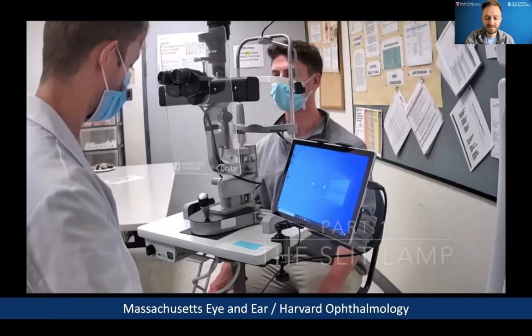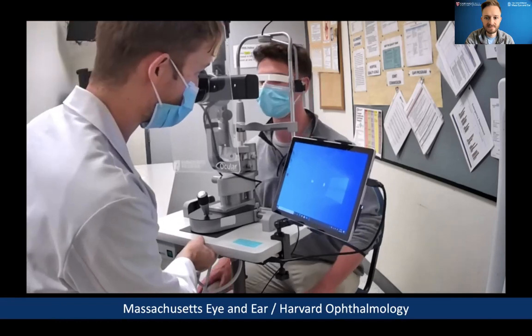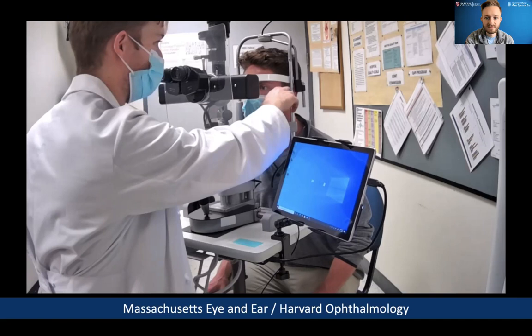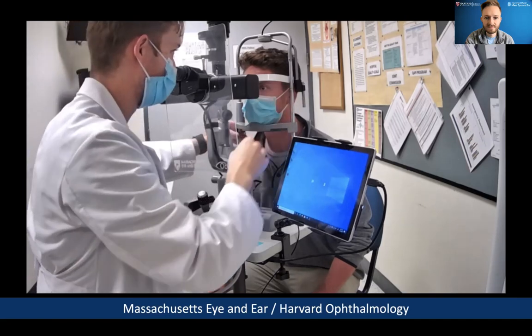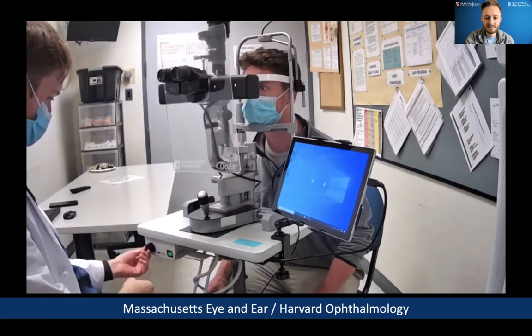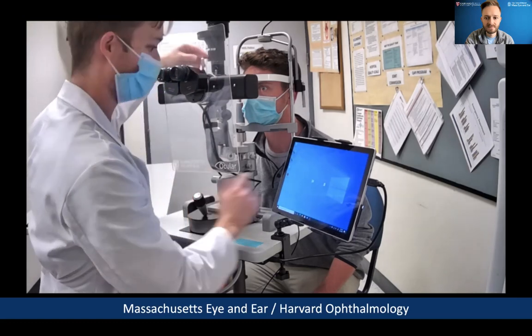First, let's talk about the slit lamp itself. Make sure that you position it at a height that's adequate for the patient, so they're not bending over too far or stretching up to get to the machine. There's a black mark I'm pointing to here that should match the corner of the patient's eye. Now that the patient's in a good position, flip the switch to turn your slit lamp on, find the right brightness with the knob, and let's begin.